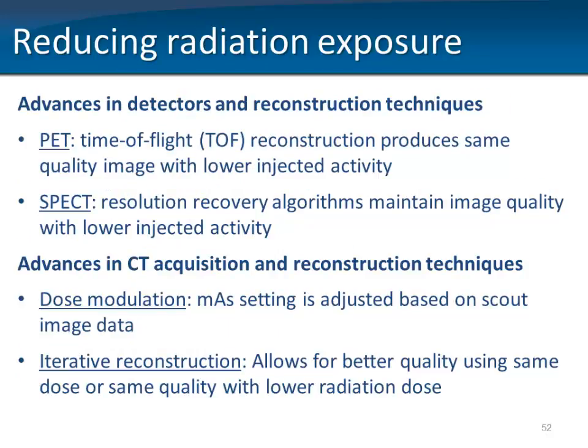So the advances in detectors that we have had can be twofold. First, for example, on PET, we have had the time-of-flight technology that has become available. So you can have the same quality with lower injected activity. For SPECT, we have the resolution recovery algorithms, but also CT is advancing.